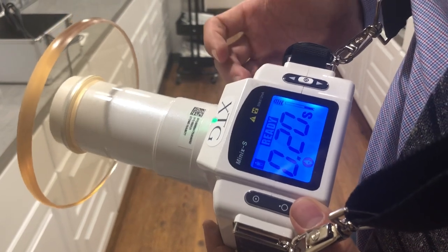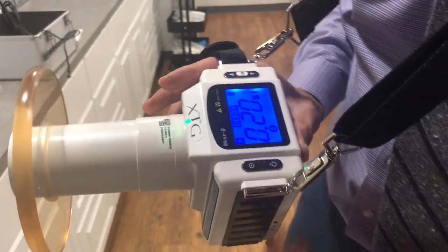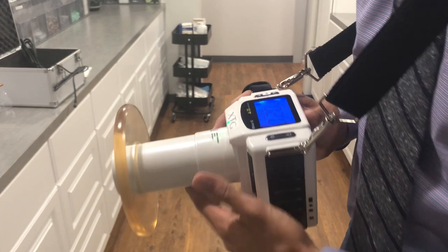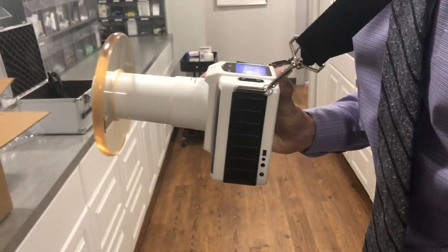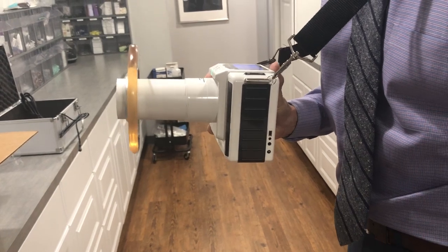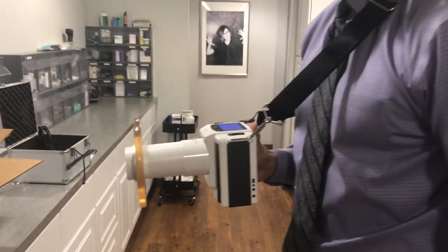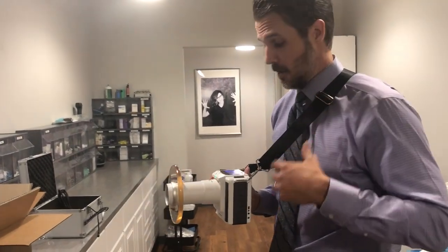To expose, your hand goes through here — I know I don't have a glove on, but you'd have a glove on. Your hand goes through here and your exposure button is right there. Take your hand and move the unit away from your body like this — it takes the weight out of the unit almost completely. You can literally take all of your x-rays with just one hand because of the strap and how good that feels.